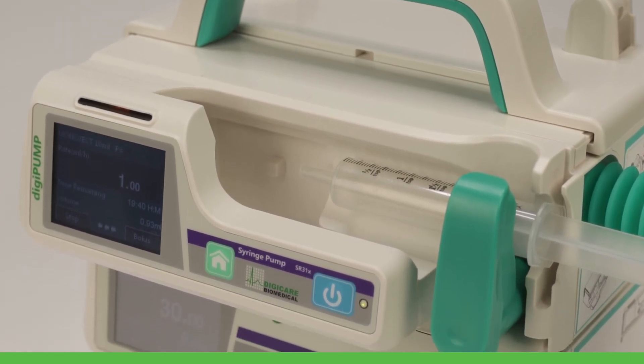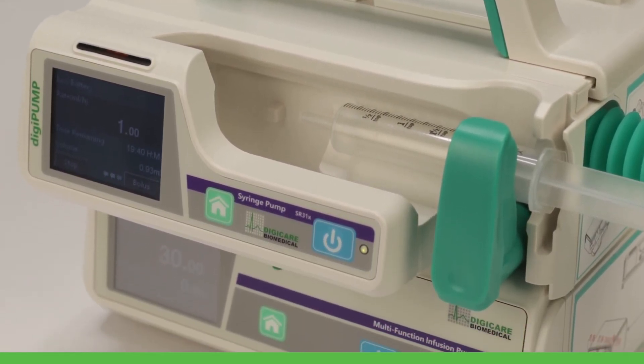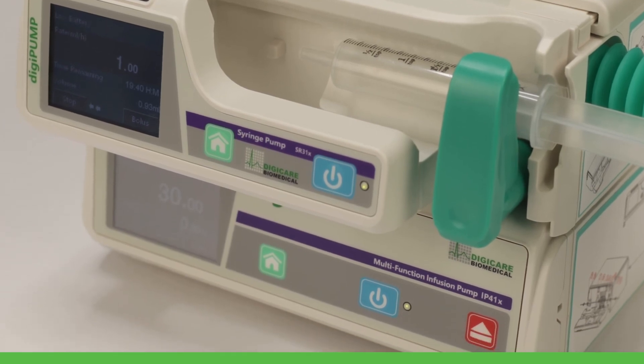To learn more about the DigiPump and order online, please visit our website at digi-vet.com.